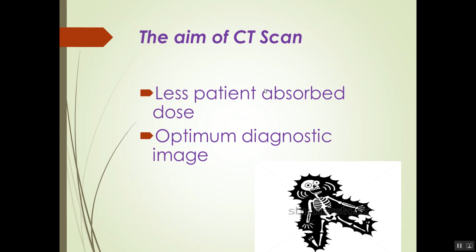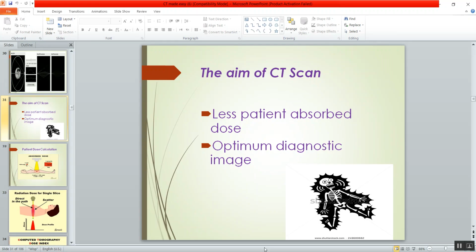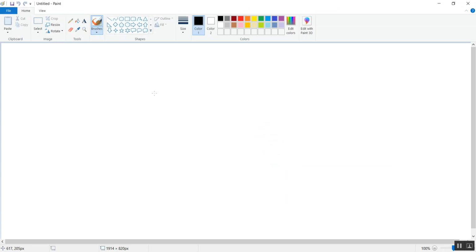What's the meaning of patient dose? The patient is absorbing radiation, so we have a term of absorbed dose, okay? Let us talk a little bit about the radiation.